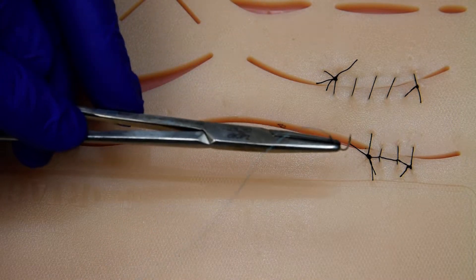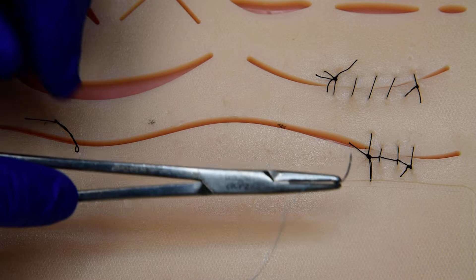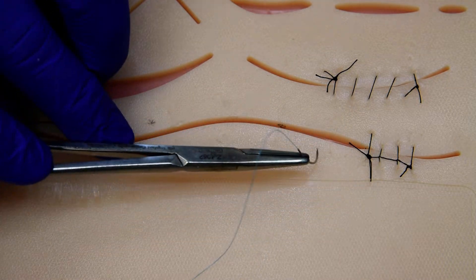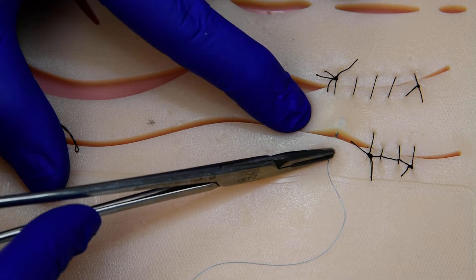Now for a double interlocking continuous, we're not going to use silk because silk is braided and has too much resistance — it'll get locked out and cause a floating knot with a double twist. Here we have a nylon sample suture.